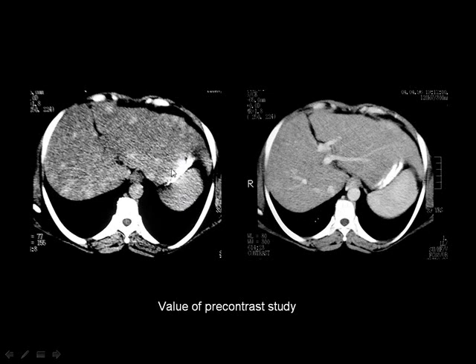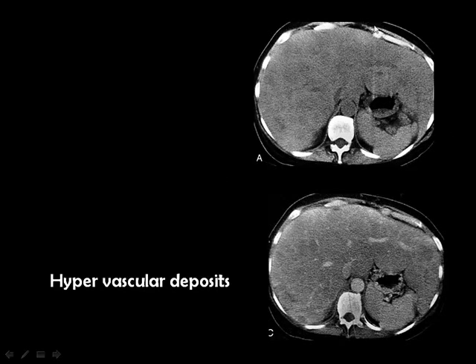If you injected the patient with contrast, you may have a chance that the lesion and the liver parenchyma take the contrast material equally. Then you cannot see the lesion. So we started to perform a pre-contrast study for the liver in particular, to look for the lesions that may enhance exactly like the liver parenchyma. Then we reach this situation.